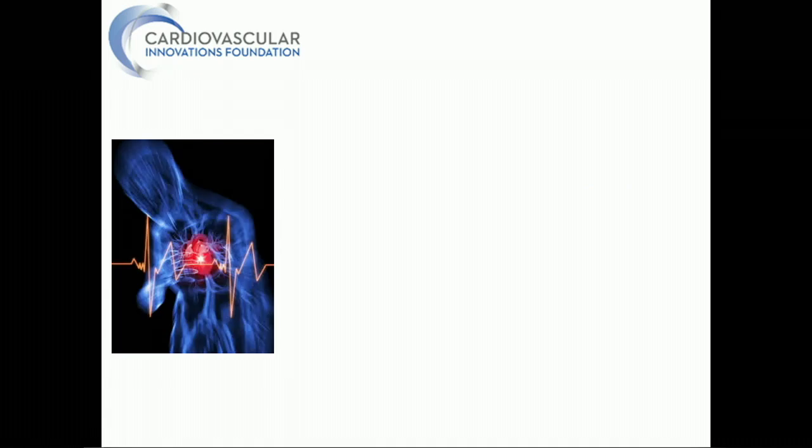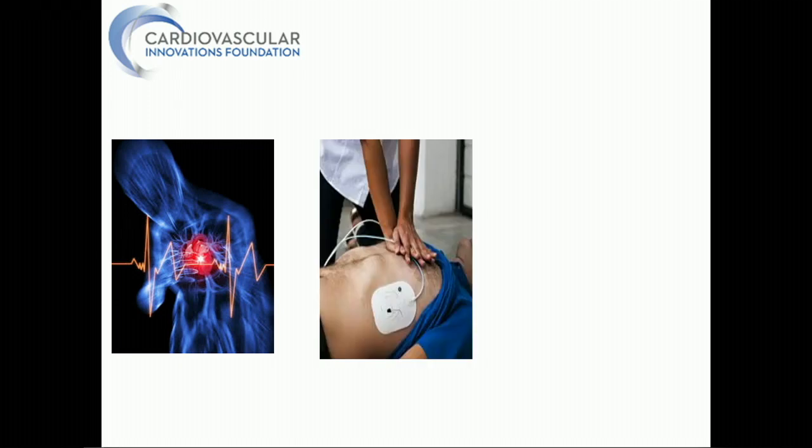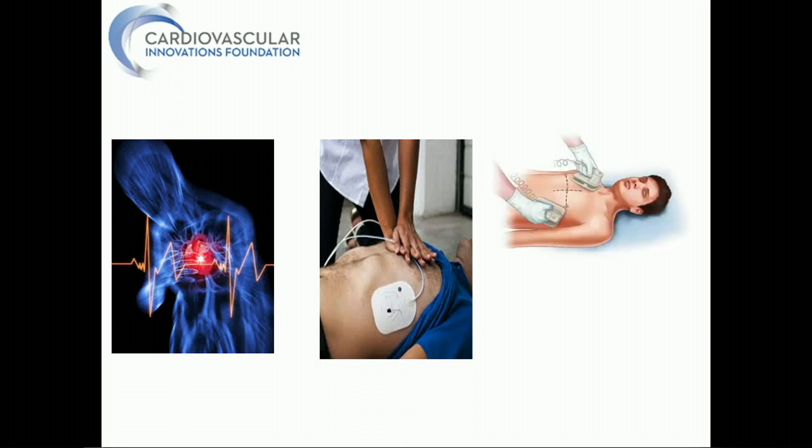On reaching the Aswan Heart Center door, the patient arrested suddenly. The Code Blue team was notified and CPR was started immediately. Upon attaching the DC device to the patient, it revealed that the patient had VF and he received a 200 joule biphasic DC shock, followed immediately by resuming CPR.